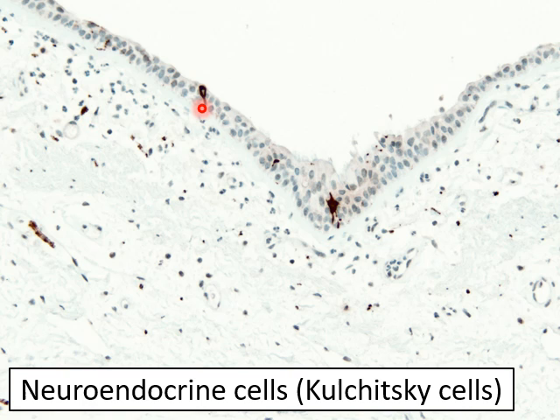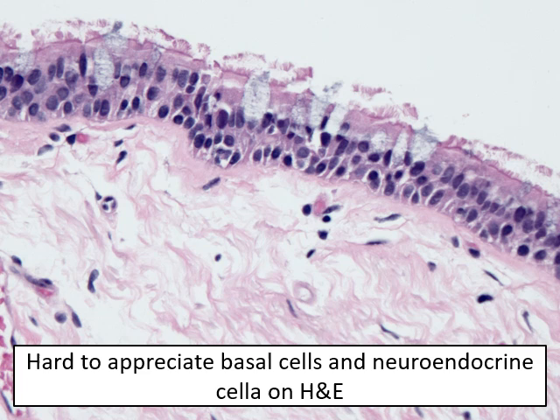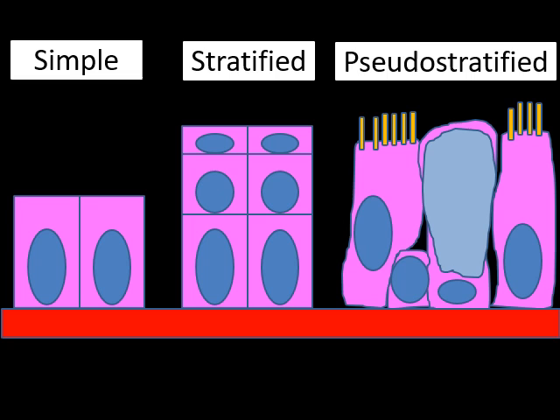Kulchitsky cells are very few in number compared to basal cells — just one here and one there. The synaptophysin stain can be used to identify them, among other stains. On H&E, basal cells and neuroendocrine cells are not distinguishable without special staining. Neuroendocrine cells are absolutely impossible to see on a standard H&E stain.